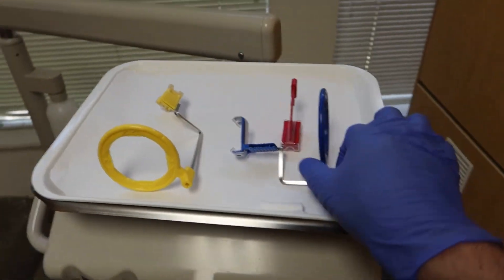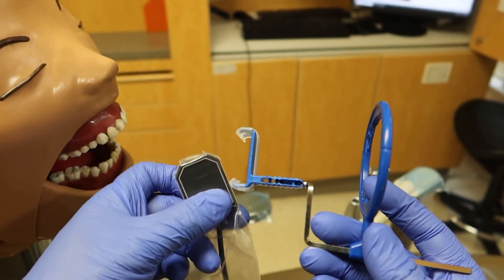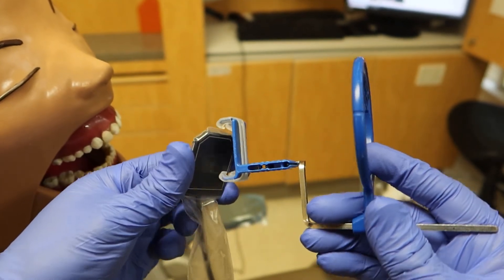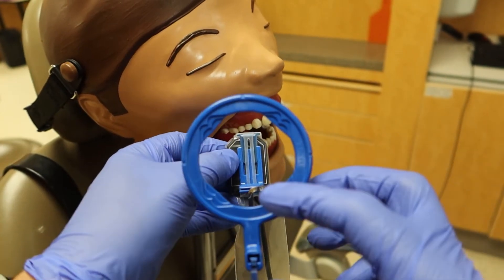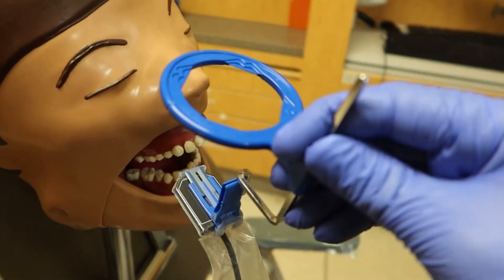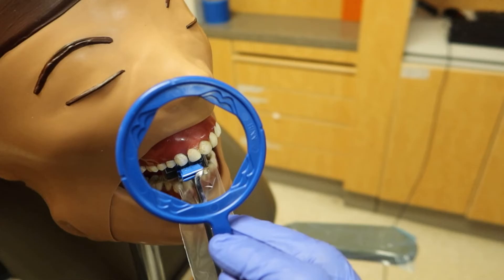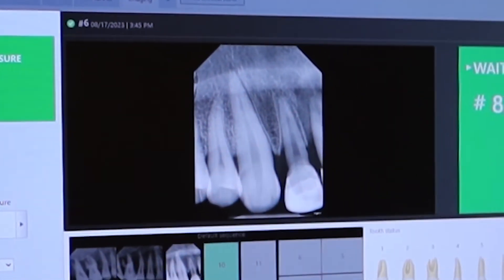When it comes to the anteriors, that's where we use the blue holder. Instead of laying it flat, we orient it vertically, and it clamps on in the system just like so. Same technique as before — start horizontal, roll it into place, have the patient bite down on the tooth you're photographing, in this case the canine. You can see from the result and aim that it comes out pretty good.